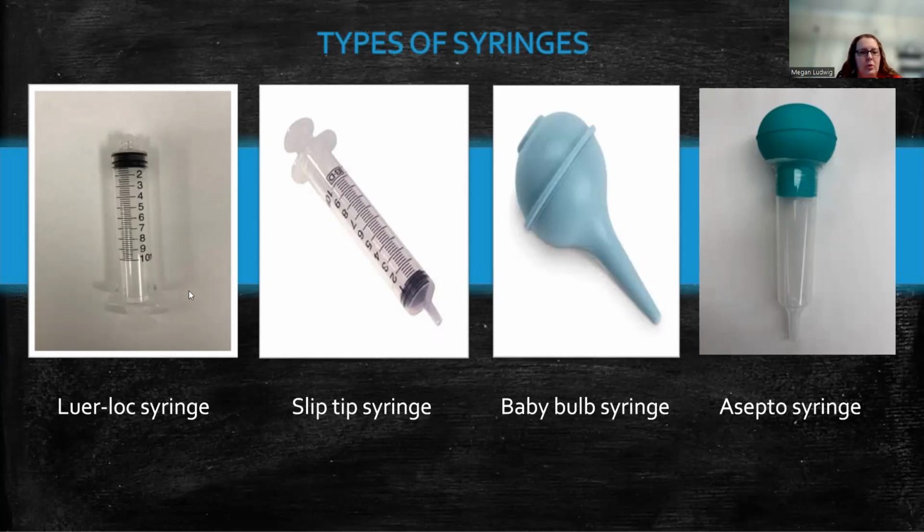Okay. So the Luer lock is really probably the most common. They even come with some that have like extra little finger holes here off the side. That's called a controlled syringe, where the surgeon can put their fingers in those finger loops and inject. It's a little easier than just these tiny little side pieces.